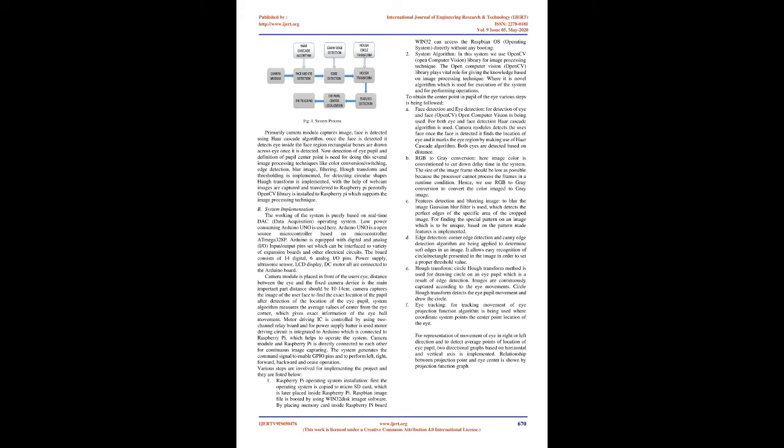To calculate the online threshold for the binary image, an adaptive threshold is adopted. By calculating the online threshold, the pupil position of the user is detected. Depending upon the calculation of black pixels present in the online threshold, the pupil position is detected and considered as right, left, up and downward. A pixel fusion method is used to obtain the accurate movement of the EPW from both eye images by calculating the sum of both eye image pixels in the same position. A Mamdani type fuzzy logic controller is used to extract the pupil position, which determines the direction of EPW movement.